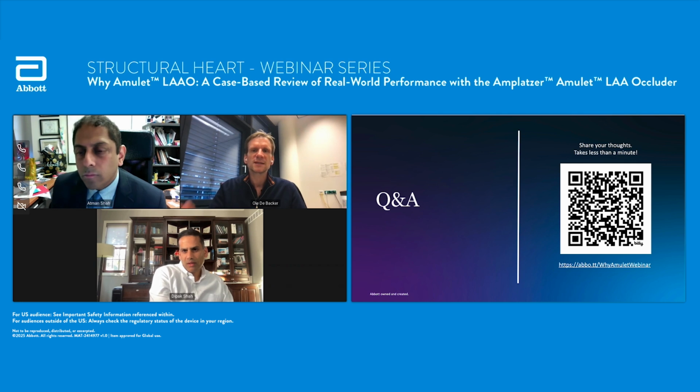Yes, so coaxiality is number one for any device. If you can obtain coaxiality, you should do it. And Atman, can I add one thing here? We talked about leaks and coaxiality and success, but getting back to your slide where you talked about experienced operators having less pericardial effusion, I think this adds to that as well. Because what happens is you really deploy slowly. I think it's very important.